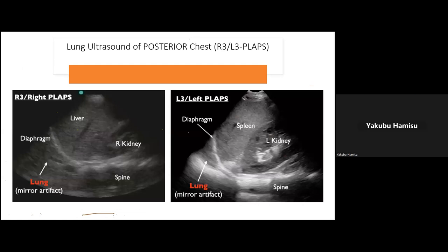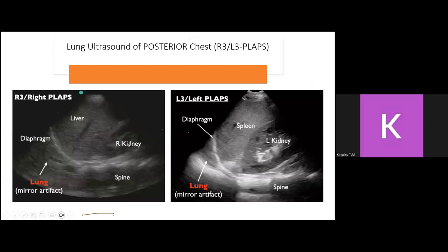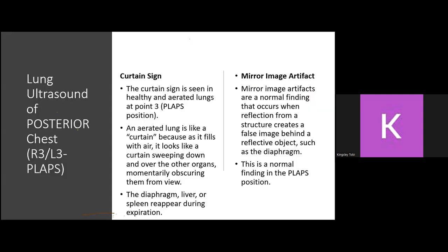All right, so this is your liver here. This is your right kidney, and you look for the diaphragm. This is the spine. If you see the spine beyond the level of the diaphragm, that is a positive spine sign, which is pathognomonic of pleural effusion. I'm sure if we have the opportunity to look at this slide, you can do this.